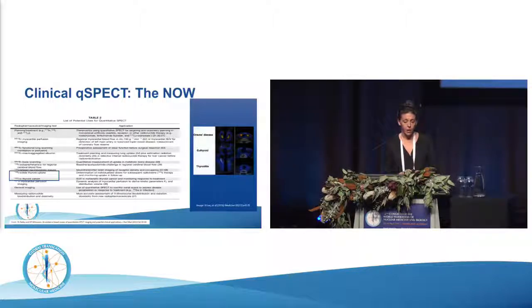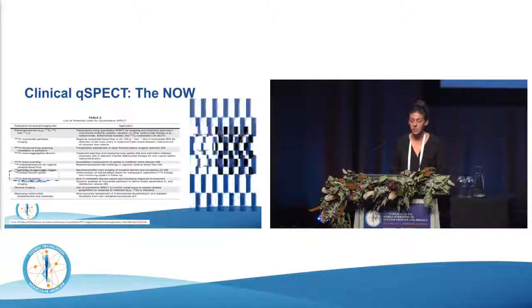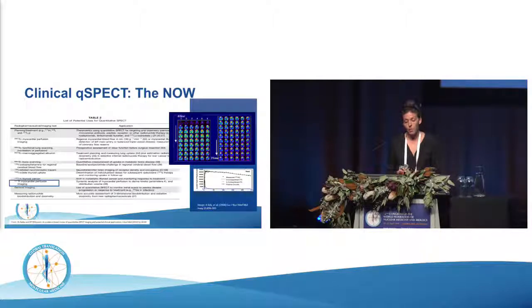Thyroid imaging, whether it be for SUV analysis pre and post treatment, determining individual dosing levels for iodine 131 and so forth. Again, I think that's something that would lend itself very readily to SPECT quantification. Myocardial perfusion imaging, quantitative SPECT, perhaps looking at some sort of dynamic imaging.